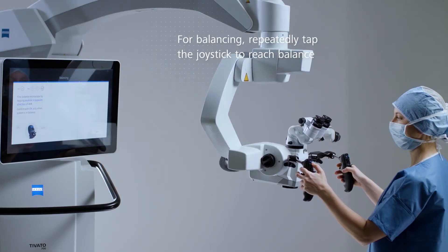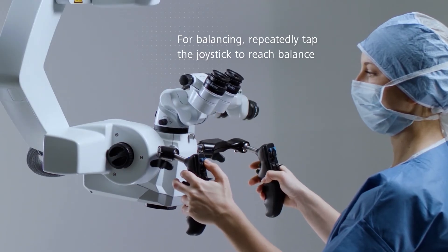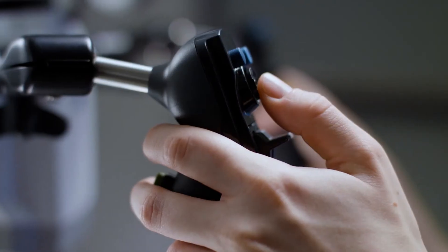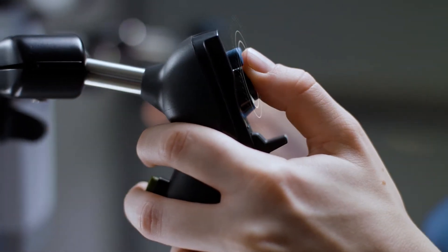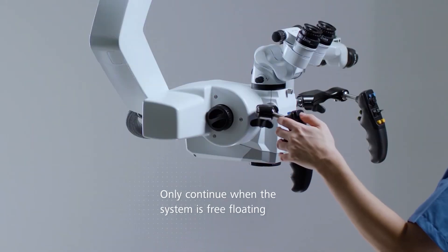Counteract the movement of the system by tapping the joystick in the opposing direction of the drift. If the system moves downwards, tap the joystick towards the top. When balance is reached and the system is free-floating, continue with OK.